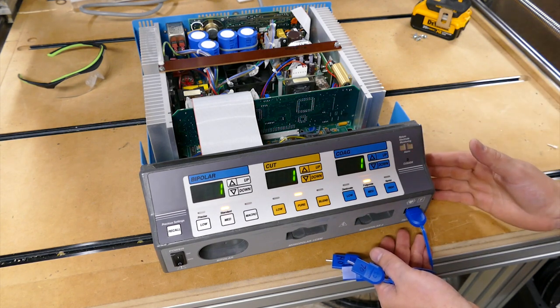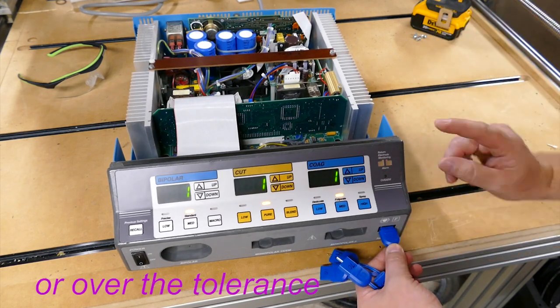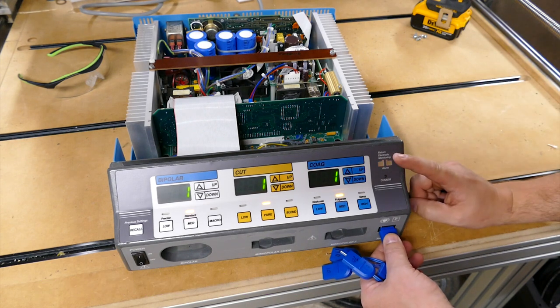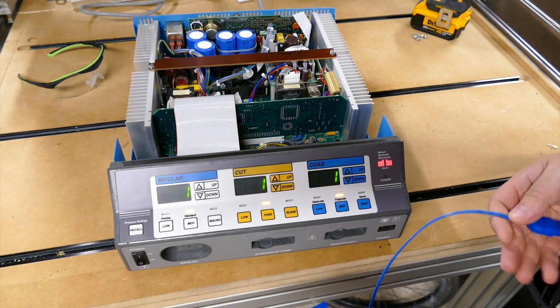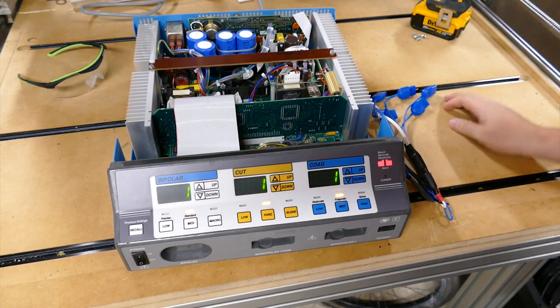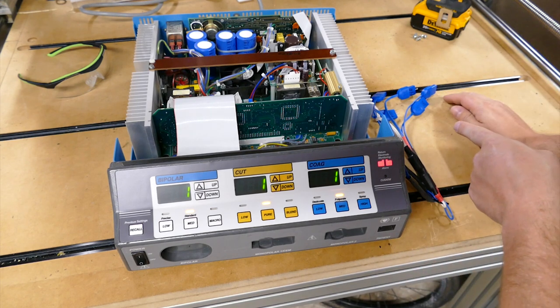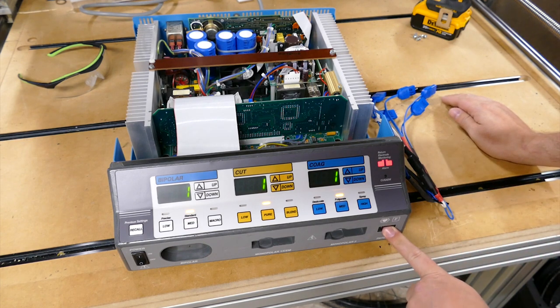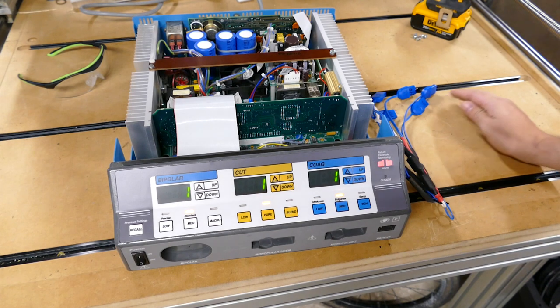We're starting to see this trend with these units all over the place where they'll either go under the tolerance and they'll still show an alarm condition, to which you will get callbacks on this exact device. And callbacks will just make everybody upset. So I'm gonna show you guys how to calibrate this unit right here using 10 ohm, 70 ohm, and 135 ohm resistors on this port. And we're also going to use an oscilloscope. So let's go ahead and set that up now.